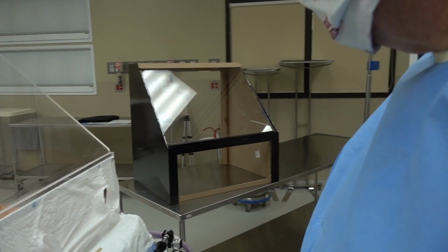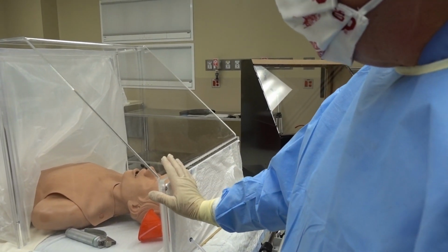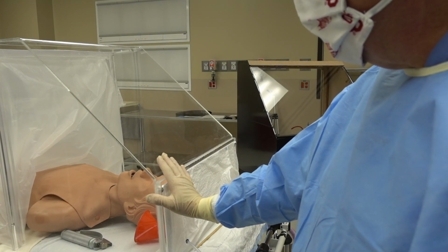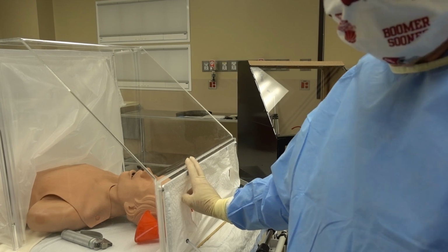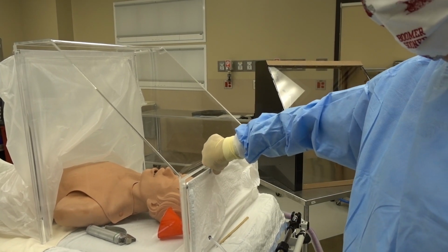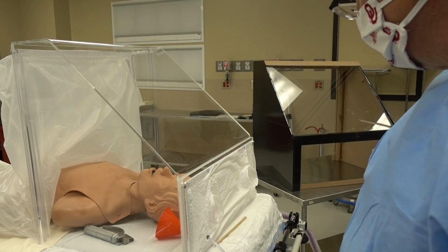Can't think of anything else. Again, if you have trouble and you have a difficult intubation and you can't do it, you just lift the box off and you do it the normal way. But most intubations, I think, can be done in this. And again, we've had novice people intubate people in this box without any trouble, and the visualization is good, and visualization is everything.